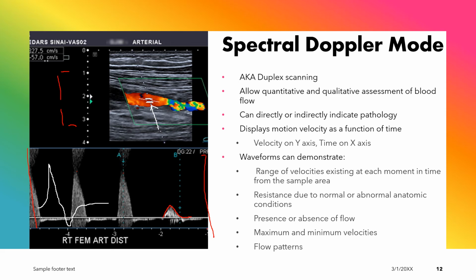So once that potential energy kicks in, we get that forward motion again. Now, in a situation where we have a very significant stenosis up ahead, what you might see is a huge increase in resistance where we would get systolic motion forward, but you see it's much slower because it's pushing against a much more resistant area. And then in diastole, it's going to drop right down to 0 or reversed. And then in our late diastole, the strength of that arterial potential energy is not able to overcome the resistance ahead. So you would see no forward motion throughout the rest of the cycle until you had your next systole. What we call this with the slow upstroke here is tardus parvus. So we get a tardus parvus systole, early diastolic reversal, no end diastolic motion at all.